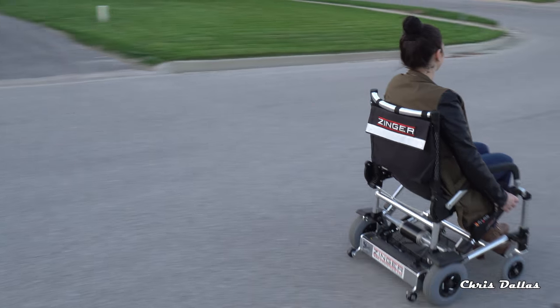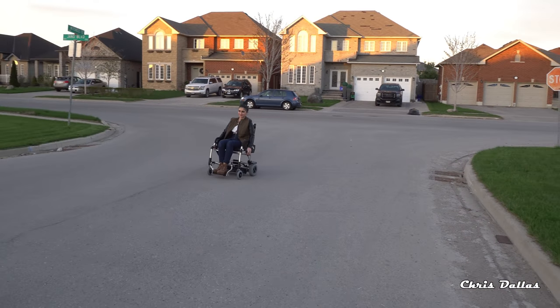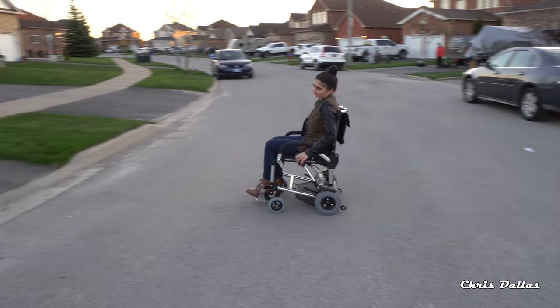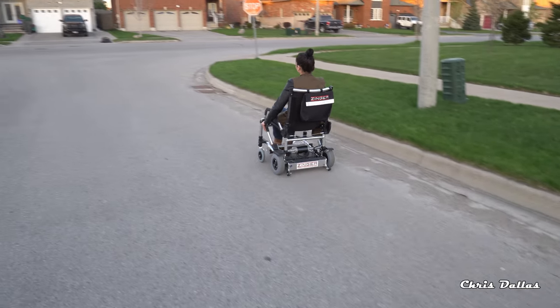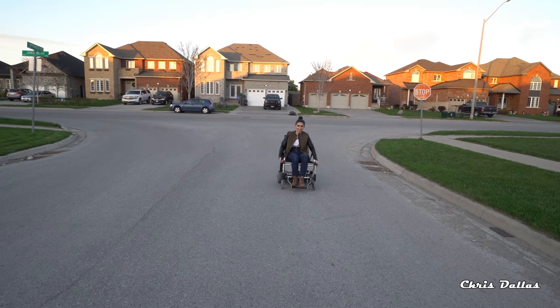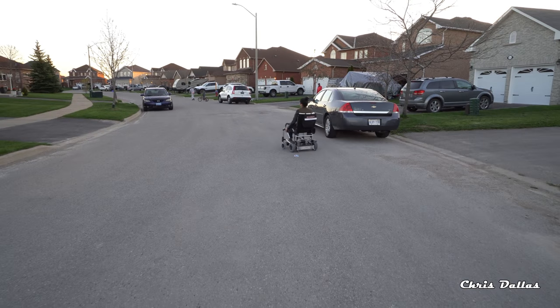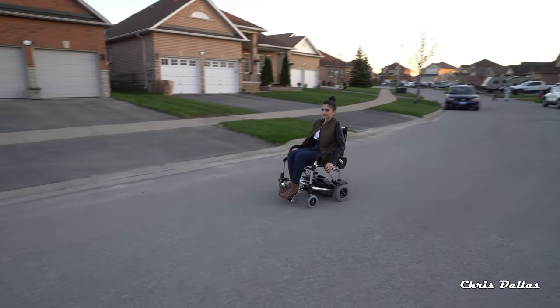There she goes. Are you at the fast speed now? Yeah, she's racing. And there she goes again, nice and fast. This is 9.6 kilometers an hour, which is 6 miles per hour. This is a very, very good speed.